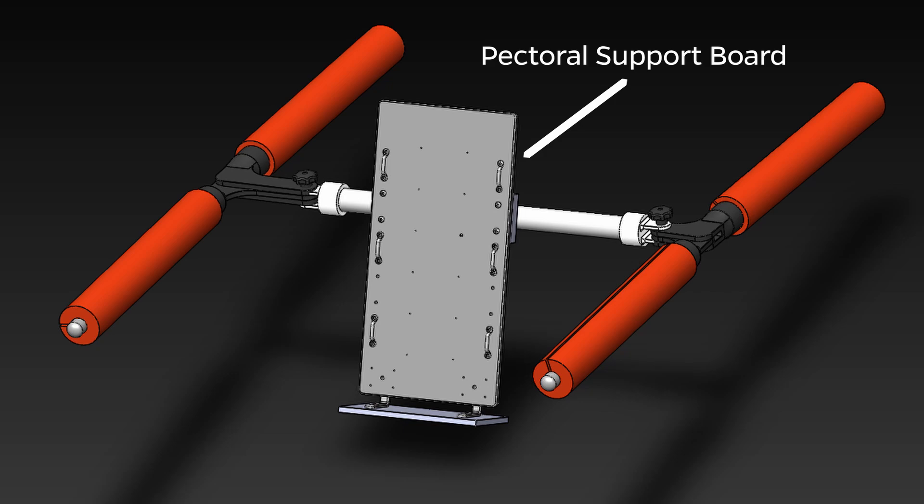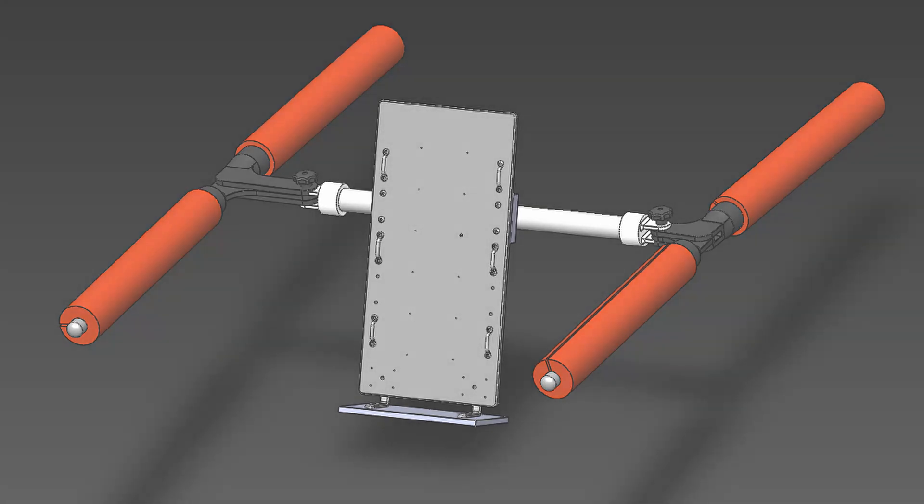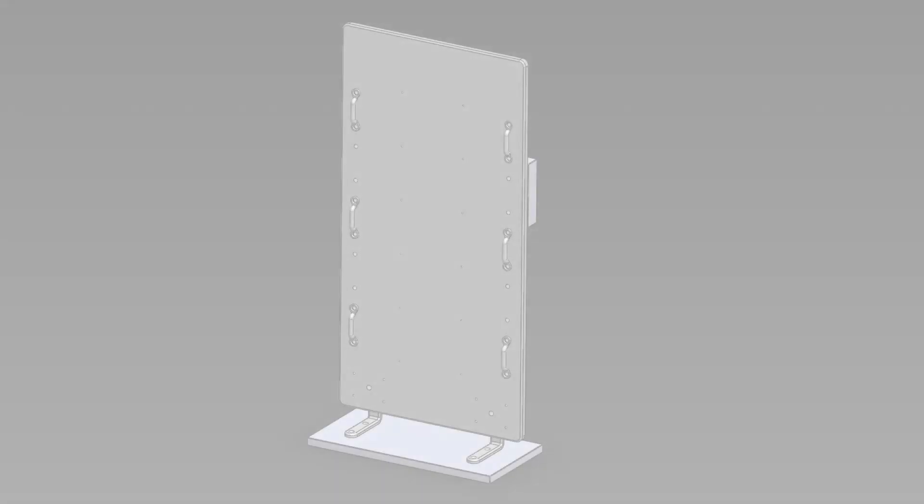The HydroStandard features a ventral support board to maintain upright position, folding L-joints to enable foldability and portability, and HDPE buoys to take advantage of natural buoyancy in an aquatic environment. These aspects of our device supplement a physical therapist's ability to engage with patients in a pool and support the rehabilitation process.